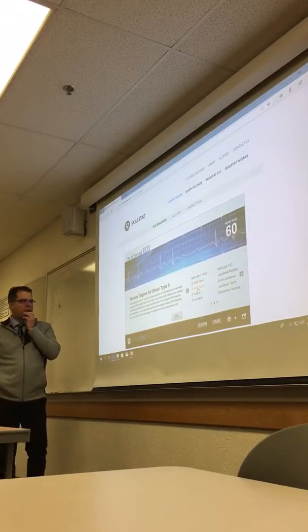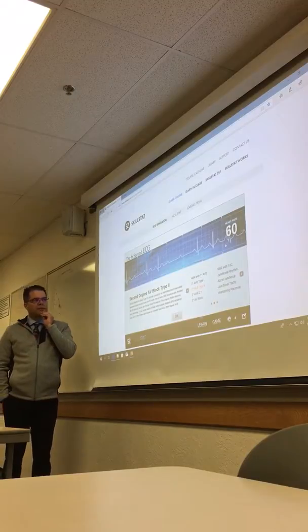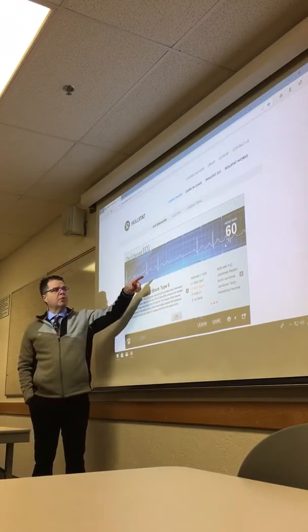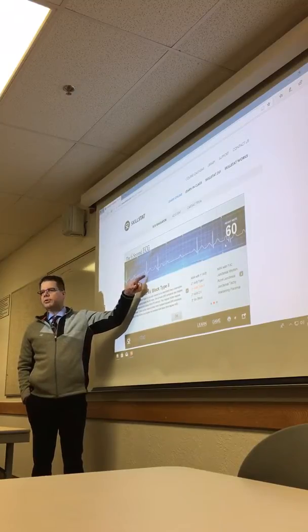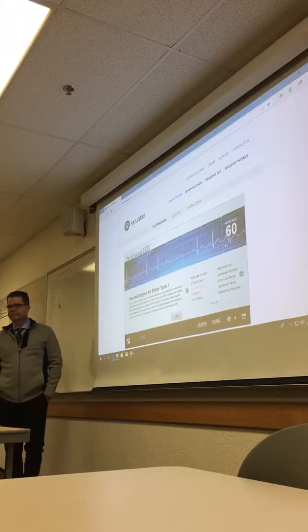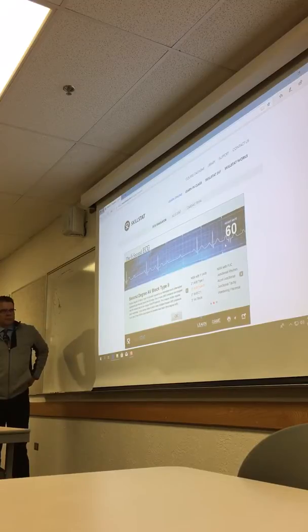Now we're going to second degree type 2s. So on the second degree type 2, we have a drop as well, and maybe multiple ones, but my PR intervals are all the same. So you've got normal sinus, a P wave with nothing, a P wave. So this can be random. This can be every other one. If it is, it's called a 2-to-1.